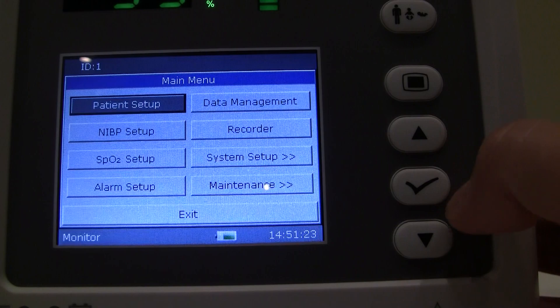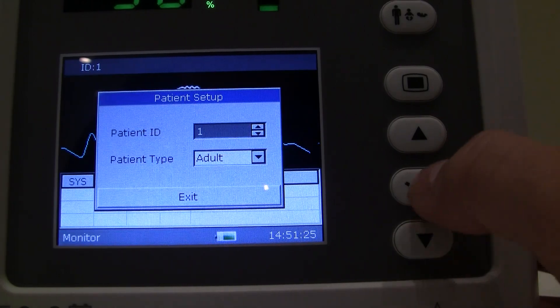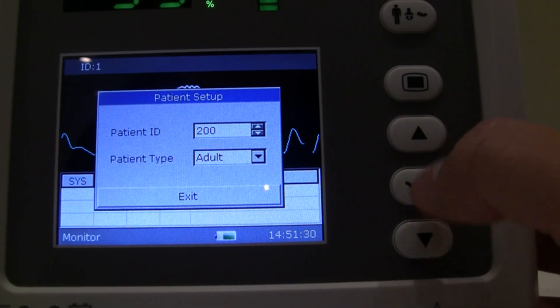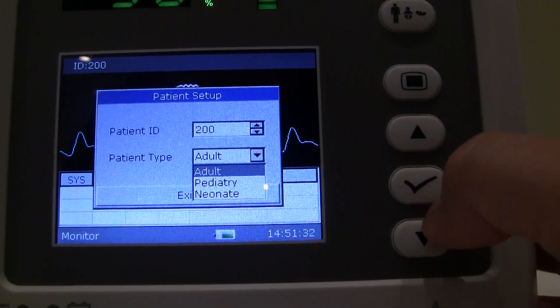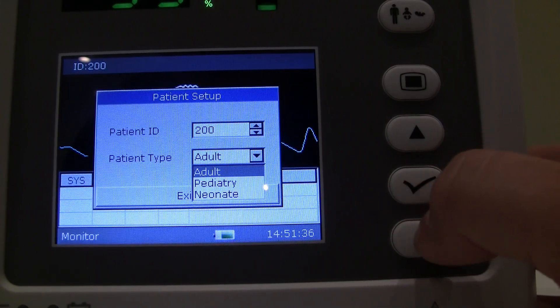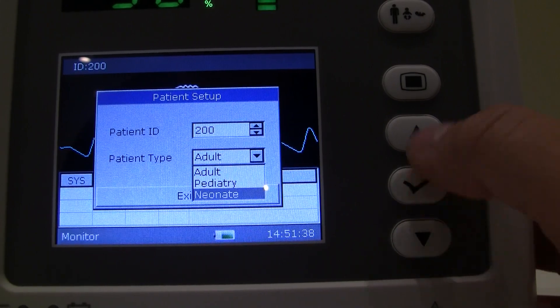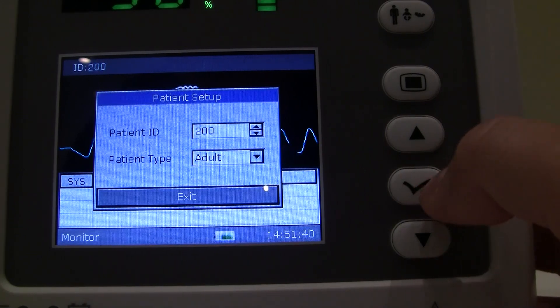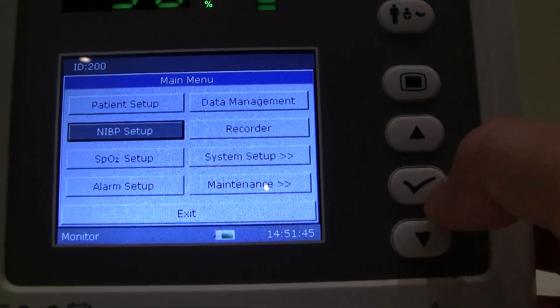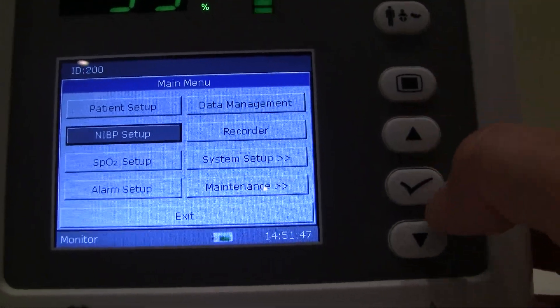For administering a new patient, go to patient setup. You can associate a patient ID number anywhere from 1 to 200, and from this section you can also select whether it's an adult, pediatric, or neonatal application — or use the shortcut key on the front of the monitor.